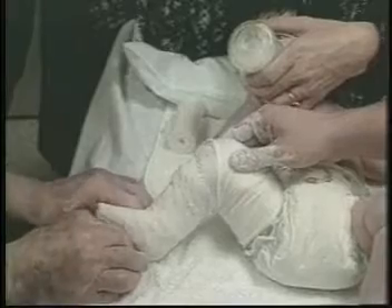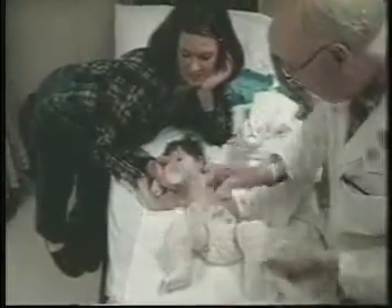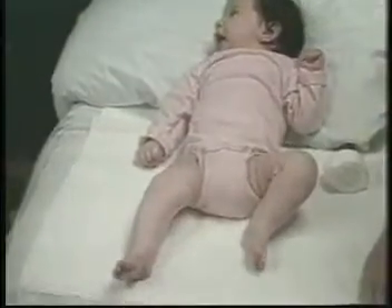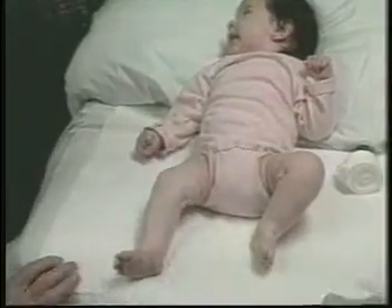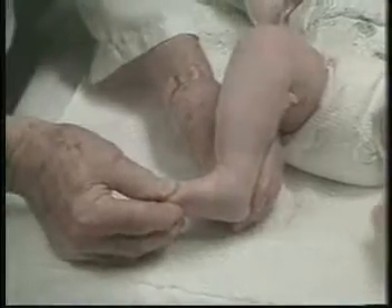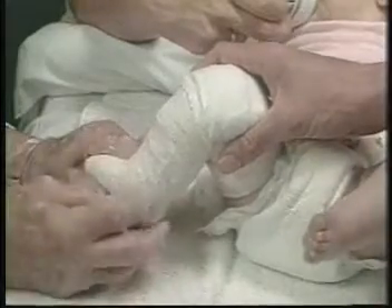A bottle of milk relaxes the baby. After the fourth casts are removed, the feet are quite noticeably improved. The cavus is now corrected. The feet are manipulated again, and plaster casts applied in 50 degrees of abduction, while the plantar flexion is being reduced. The casts are well molded and hold the feet in 50 degrees of abduction, and the feet are not pronated.